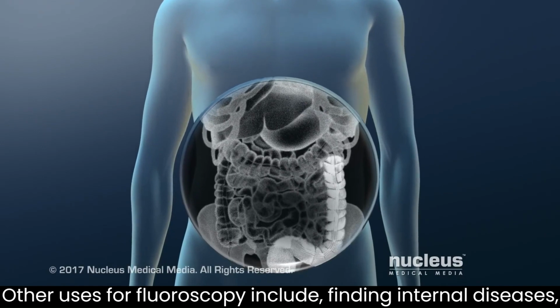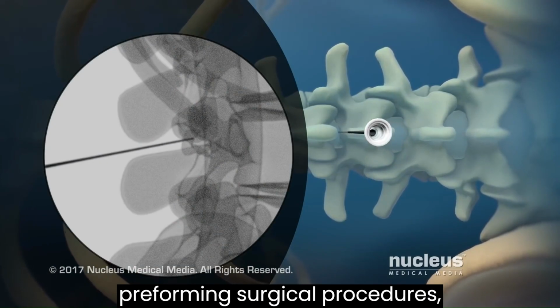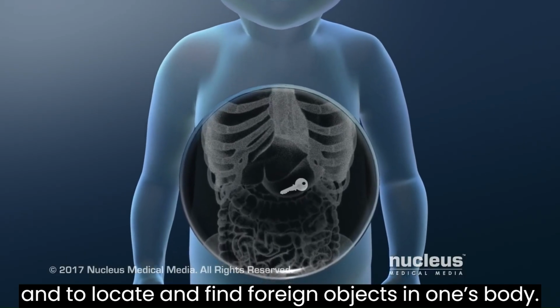Other uses for fluoroscopy include finding internal diseases, performing surgical procedures, diagnosing heart problems, and locating and finding foreign objects in one's body.